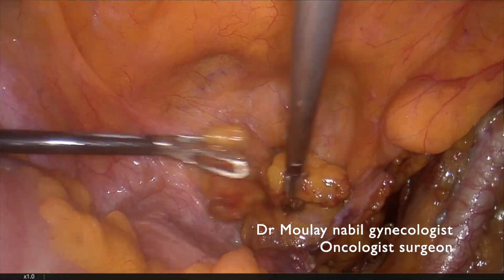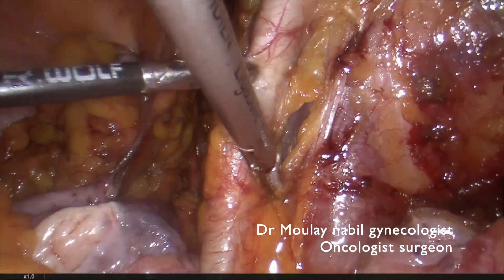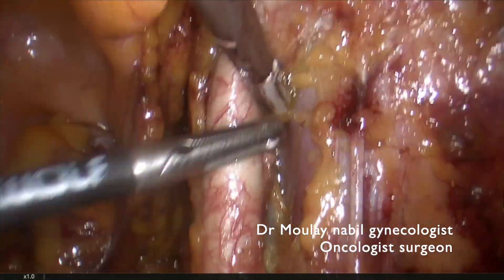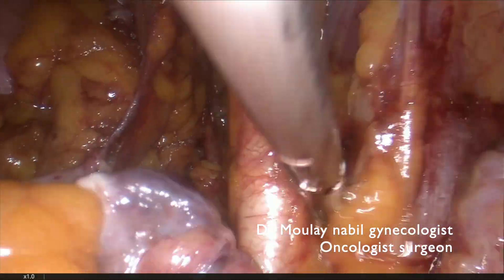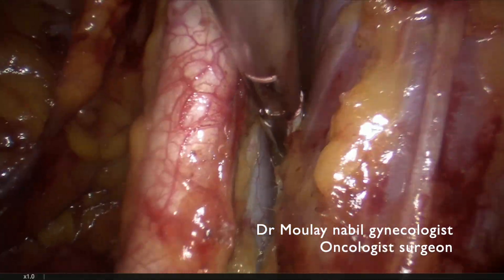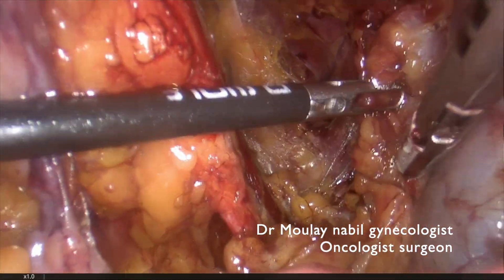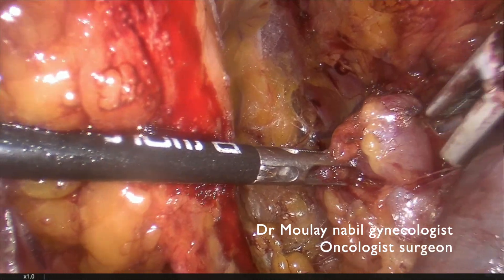We will place this node in the vesicovaginal space. The second step is to pull in the external iliac artery, which allows us to disconnect this artery from its psoas attachment. This manoeuvre allows us to remove all the lymphatic chain which is just below the external iliac vein, and we find the second suspicious metastatic node that was revealed on the MRI.